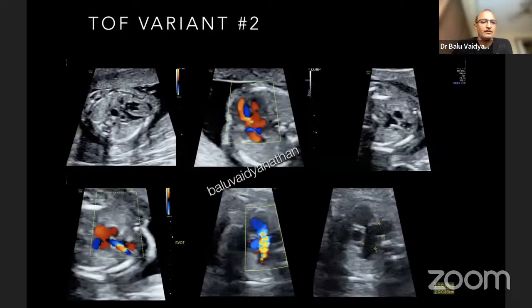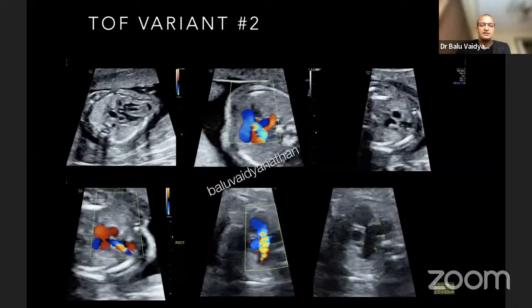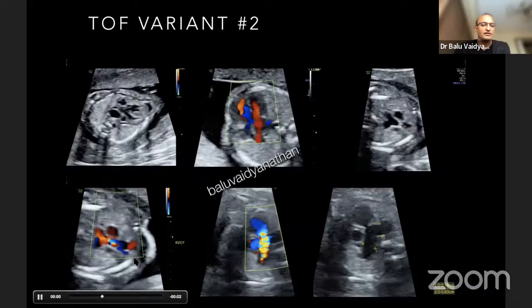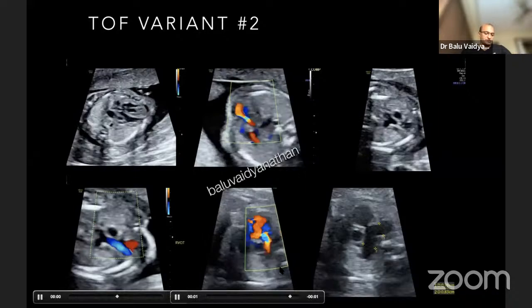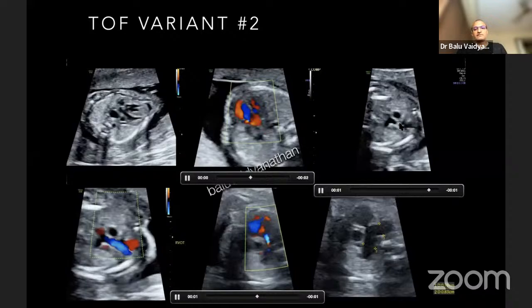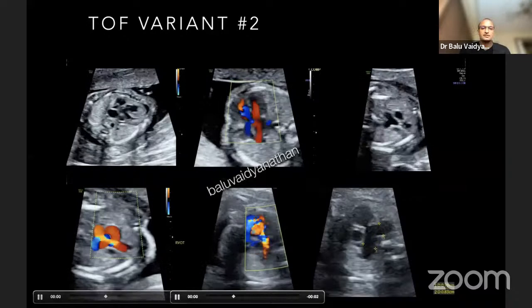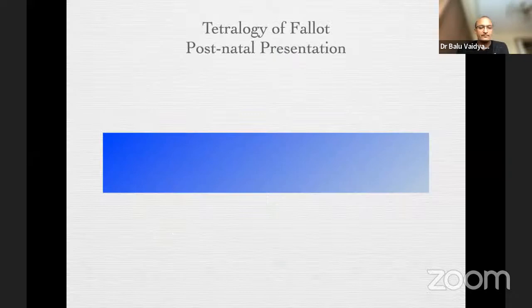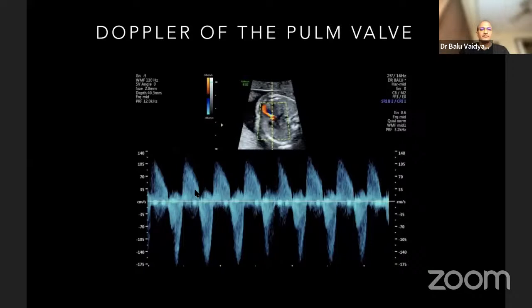Another example of TOF: there is an overriding aorta, and when you look at the pulmonary artery outflow, you find this very characteristic picture of a to-and-fro flow into the pulmonary artery — both stenosis and regurgitation. The pulmonary arteries are enormously dilated. There is a dysplastic pulmonary valve with both stenosis and regurgitation and dilated pulmonary arteries. The Doppler of the pulmonary valve shows both systolic and diastolic flow — pulmonary stenosis and regurgitation. This is an example of tetralogy of Fallot with absent pulmonary valve, a variant of tetralogy.